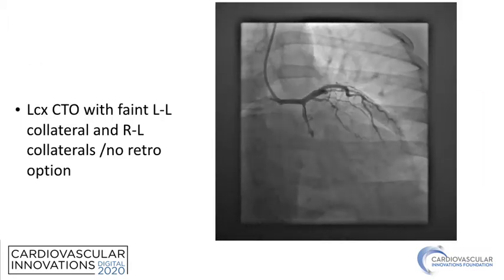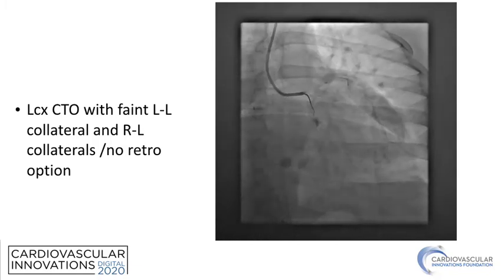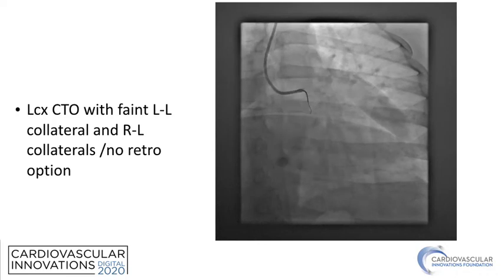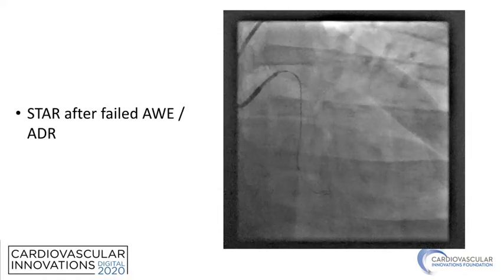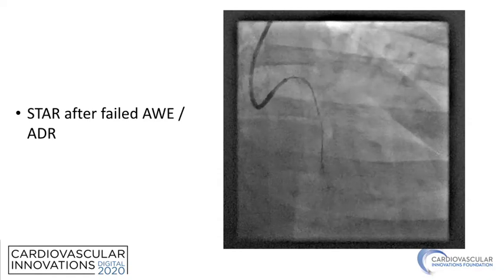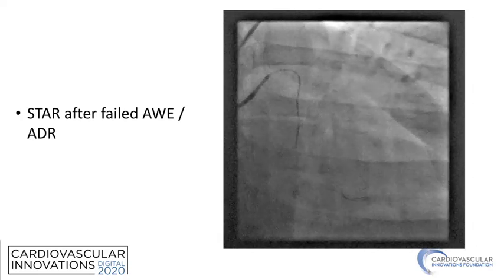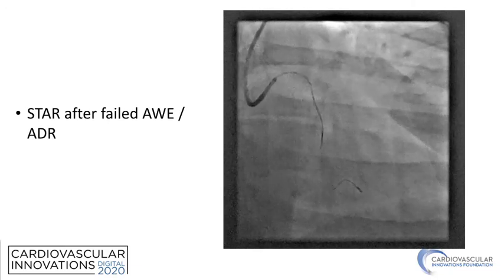Here is a case of a circumflex CTO, relatively short, with a single OM outflow, no interventional collaterals, and a relatively small vessel. After spending some time trying to wire this, the wire ended up in the sub-intimal space. Stingray was not successful, so the decision was made to proceed with STAR. You can see the knuckle advancing in the OM, re-entering the true lumen in the mid portion, as evidenced by the abrupt change in caliber of the knuckle.